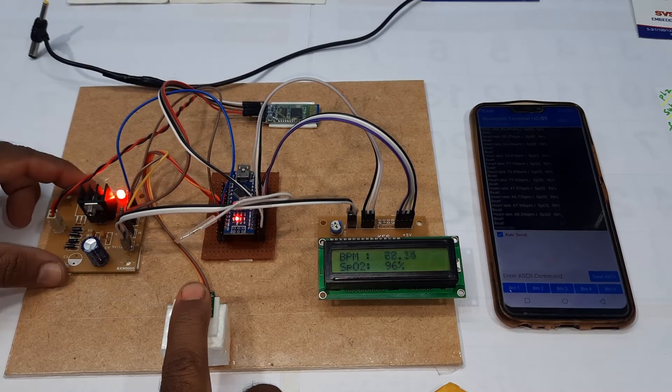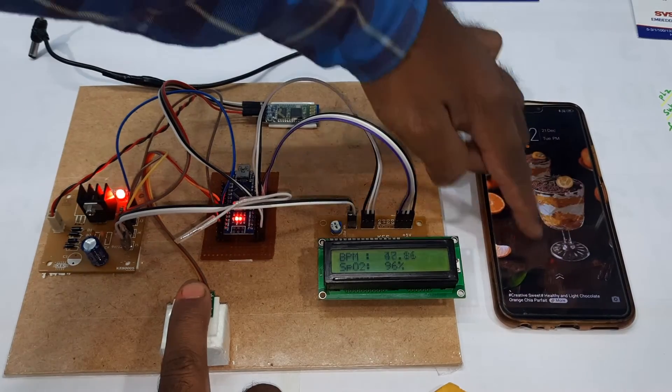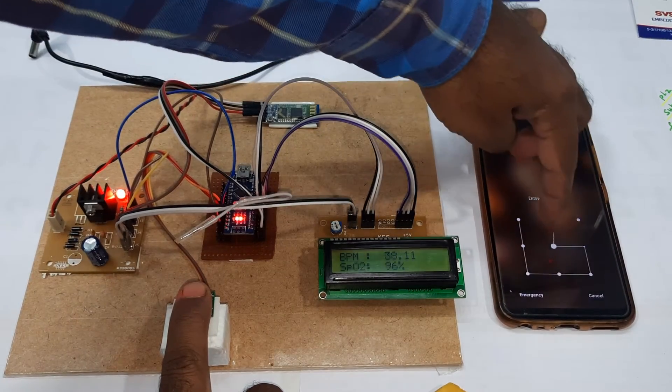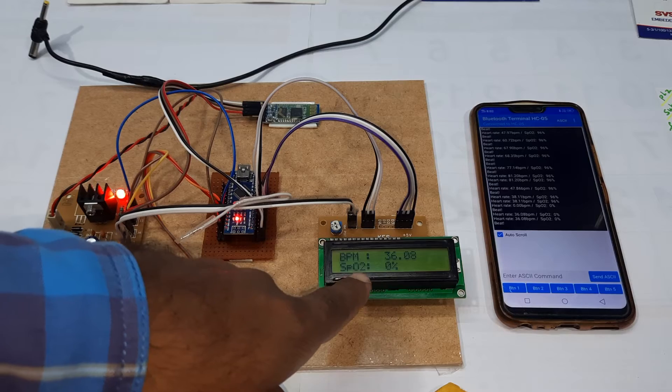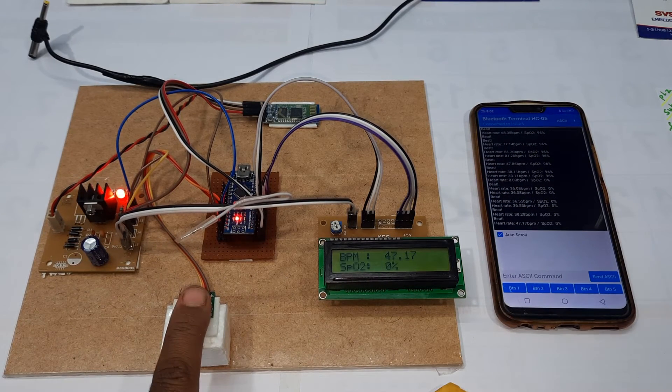Here you can see the components: power supply board, Arduino Nano, Bluetooth module, 16x2 LCD display, and the MAX30102 sensor.